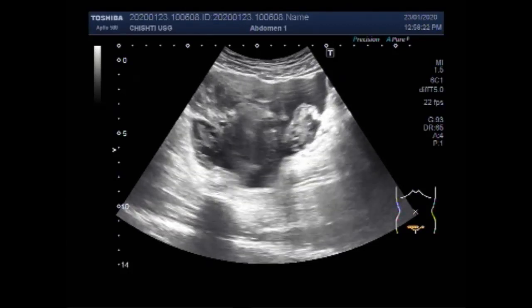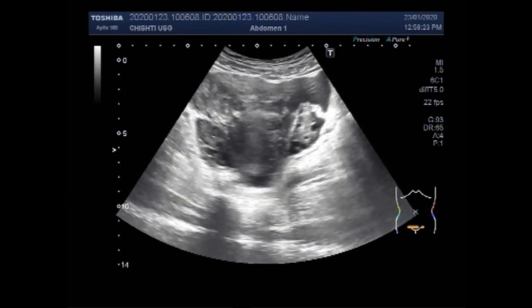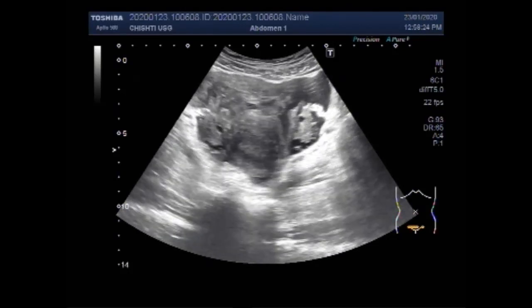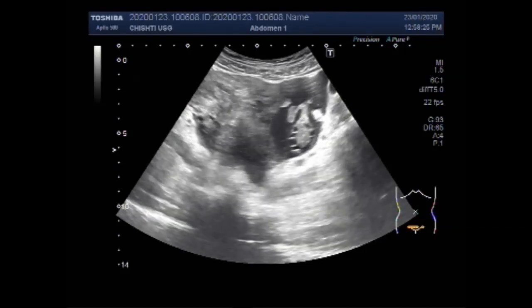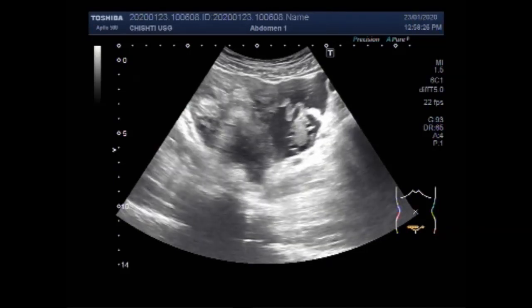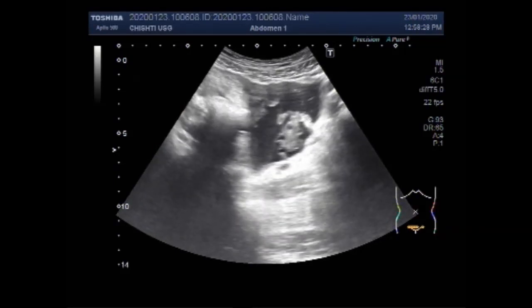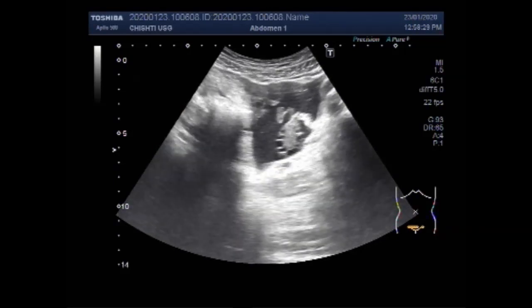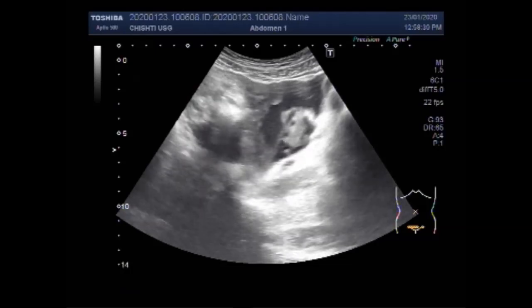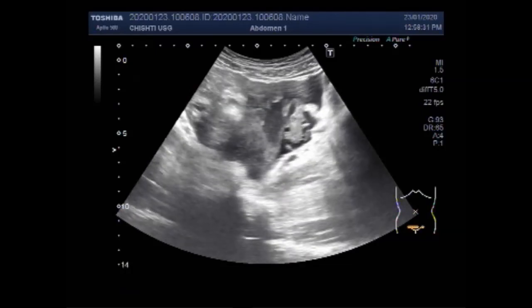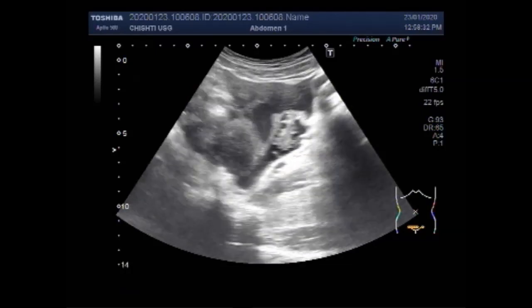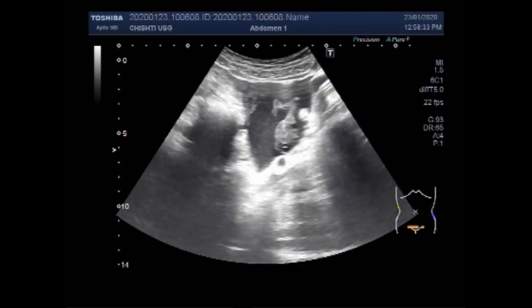So it is likely the right fallopian tube that is ruptured. Now you can see the right ovary and the fallopian tube also.